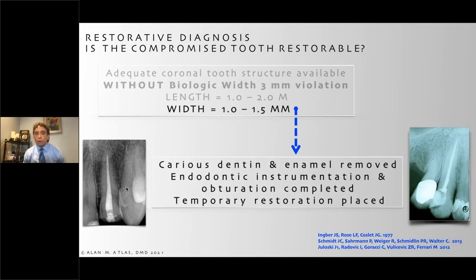After I remove the caries, I've done the endodontic instrumentation and obturation is completed, and the temporary restoration is placed by my endodontist. And again, we're going to look at this particular stage later, because this particular stage is, I believe, a big problem. I think we're setting ourselves up for failure when we perform this last part of it. In other words, placing a temporary restoration after the endodontic treatment is completed. So this is where we're going to make some changes.